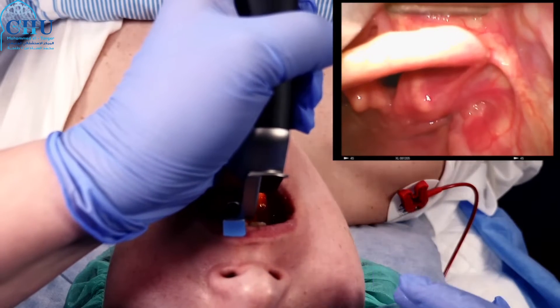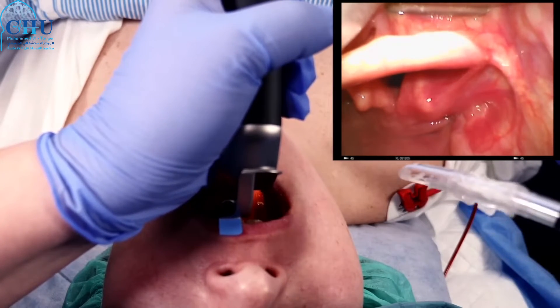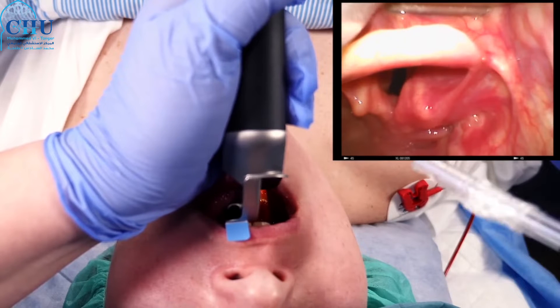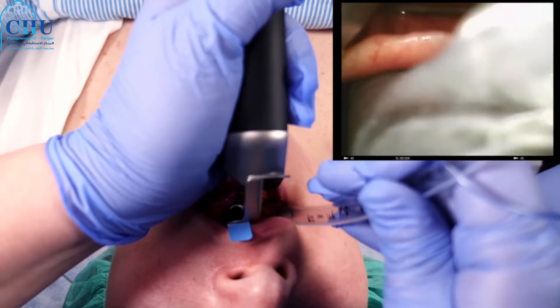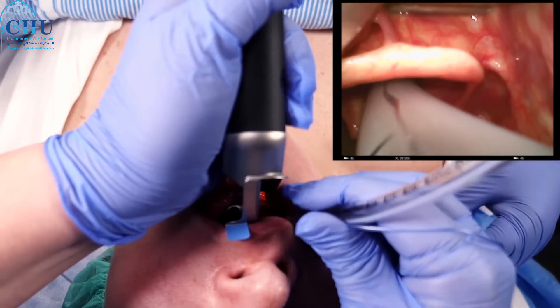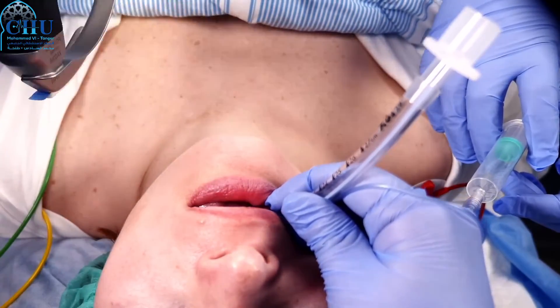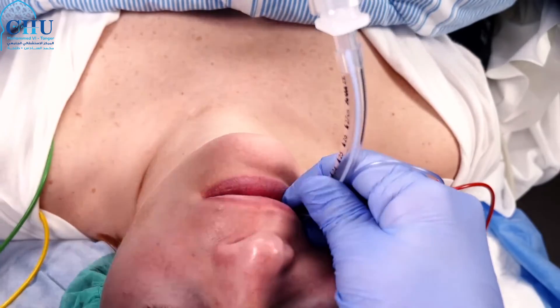Make sure you don't pinch the lips and do not exert any pressure on the front incisors. By now you hopefully have a clear view of the opening of the trachea — a dark slit between the pale vocal cords. Insert the tube carefully; sometimes a gentle rotation is required to pass the vocal cords. Advance the tip until the cuff has disappeared and the vocal cords are between the two black lines. Ask for inflation of the cuff and carefully retract the laryngoscope. Hold the tube firmly while you confirm that it's lodged in the trachea and not the esophagus.